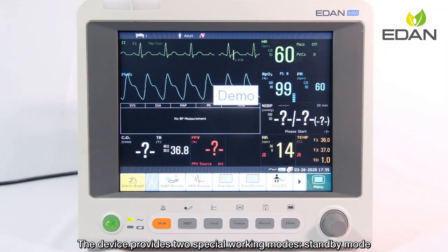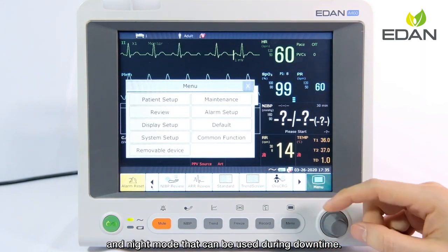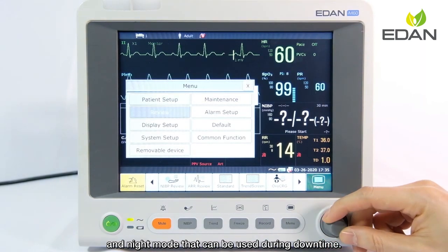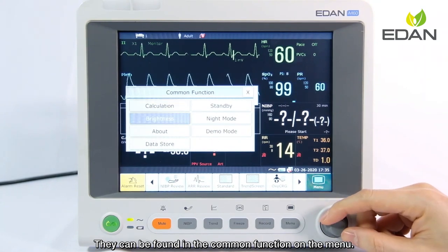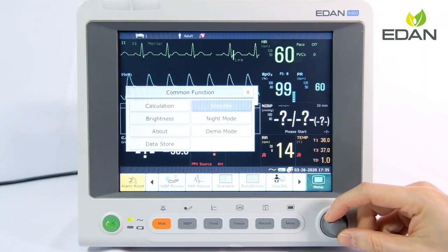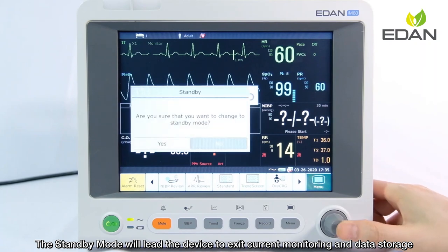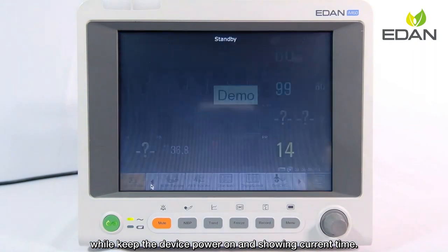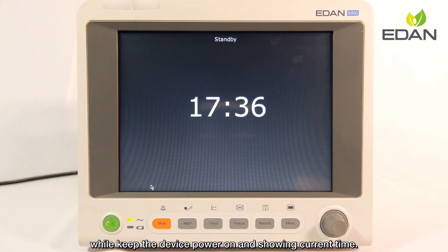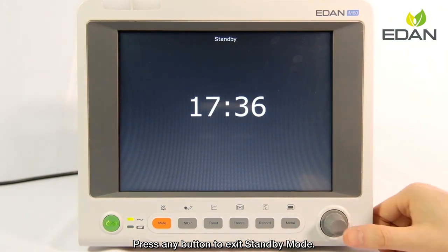The device provides two special working modes — standby mode and night mode — that can be used during downtime. They can be found in the common function under menu. Standby mode causes the device to exit current monitoring and data storage while keeping the device powered on and showing the current time. Press any button to exit standby mode.